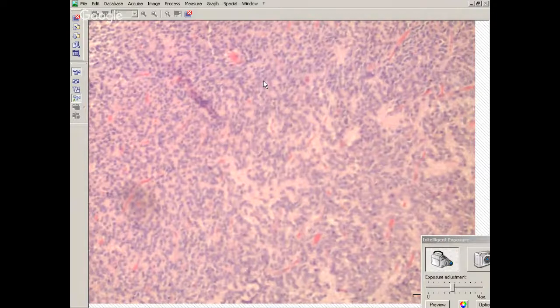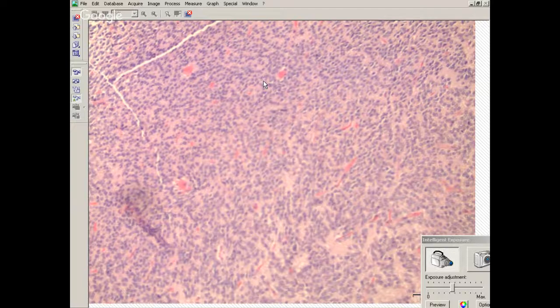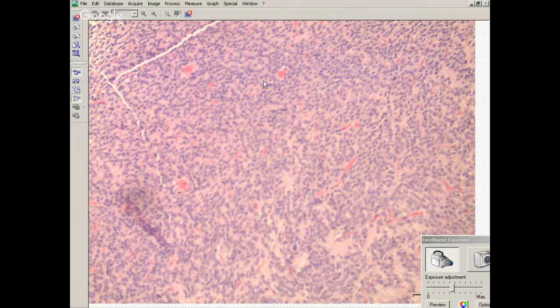Occasionally, when they're removed, they can have mitotic figures. If they do a biopsy and don't remove the whole thing, or they do a staged resection, when they go back again, there might be a little bit of necrosis, there might be some mitotic figures from reactive changes from the original resection if it was a short period of time prior. So you always have to have the clinical story to find out whether or not it was just recently resected, because it can alter the histologic appearance and make it look like it might be a higher grade and have some atypical features. Most of the time, there are no mitotic figures.